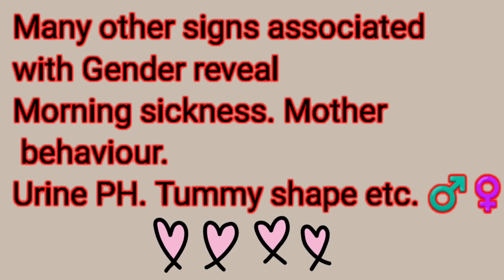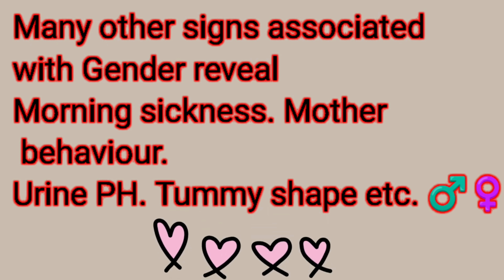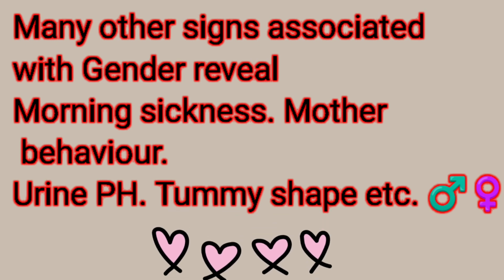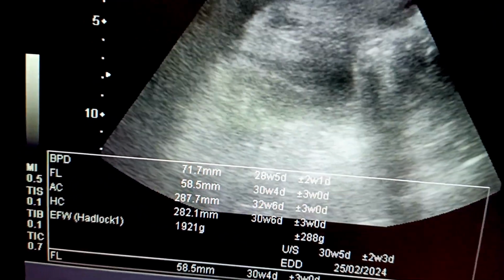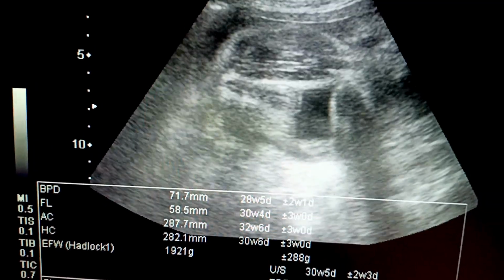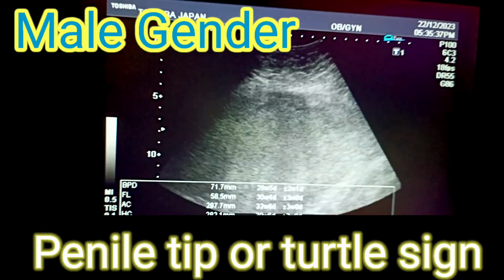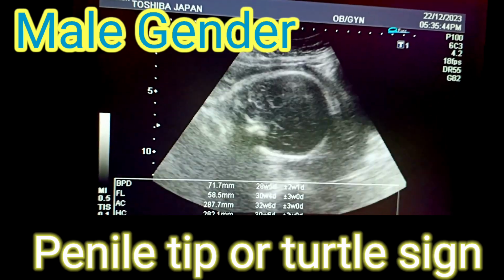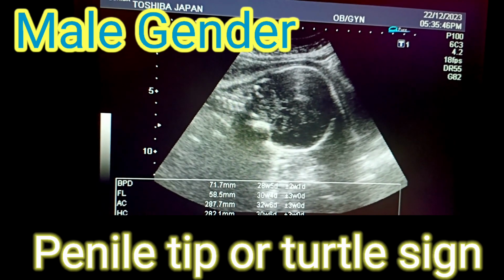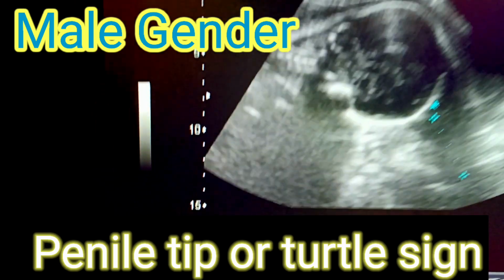There may be some other signs associated with the gender reveal, like morning sickness, mother's behavior, urine pH and the shape of the tummy. They can help in predicting the gender of the baby. So this is the femur length and you can see the gender is male. There is the turtle sign, or the penile tip, present between the two femur bones. So the gender is male, with a low-lying placenta, posterior position, and a heart rate less than 140 per minute.